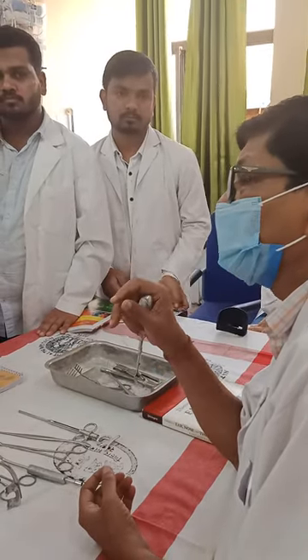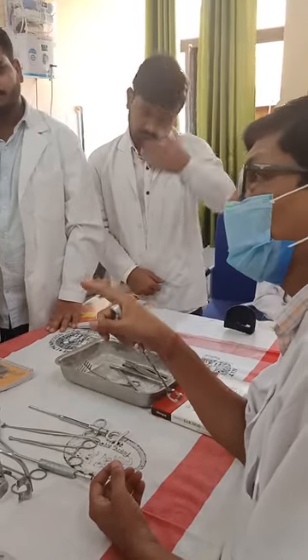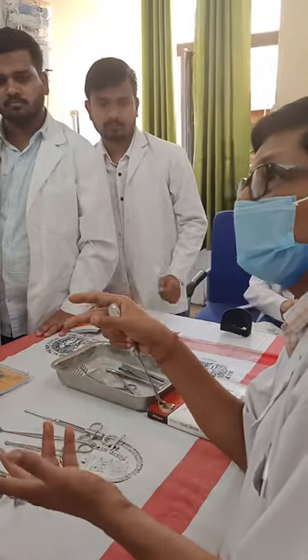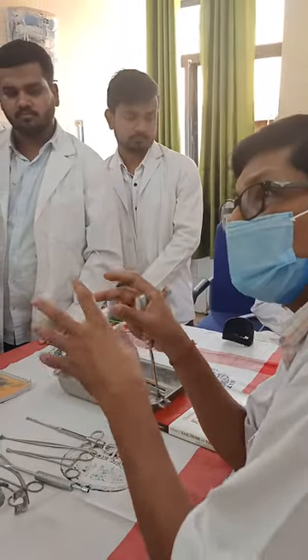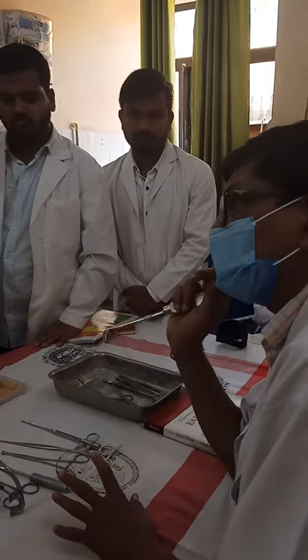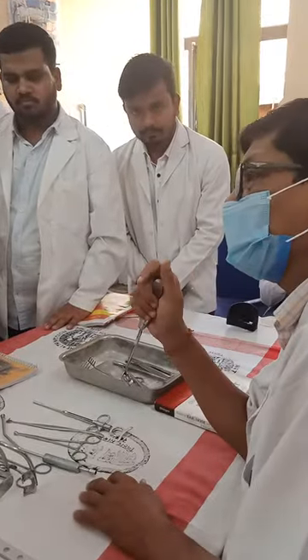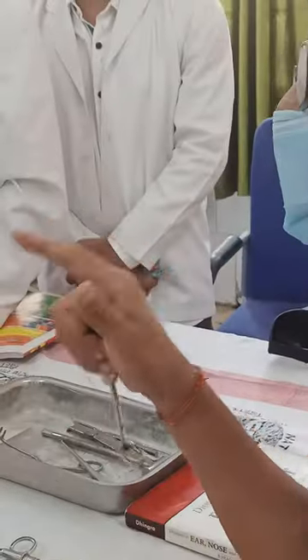How to move the instrument after operation? After operation, how do you make the instrument clear? How to make the machine clean after the procedure?